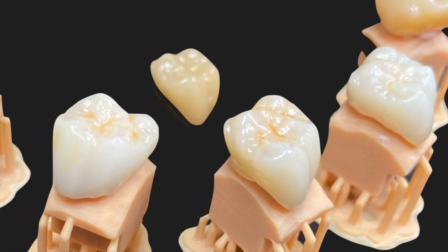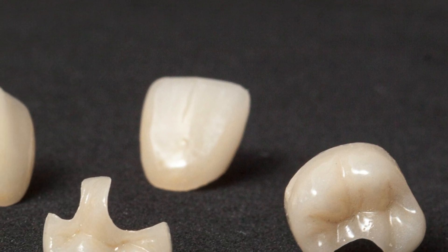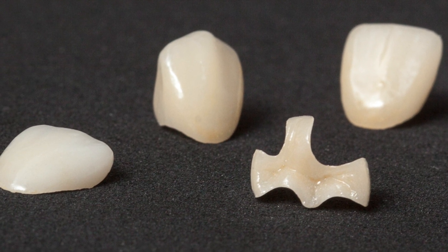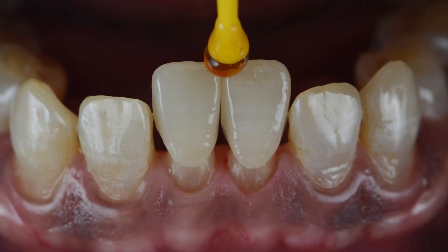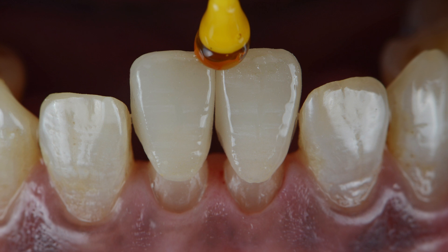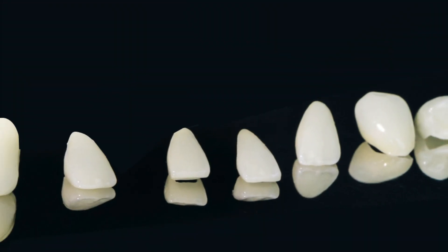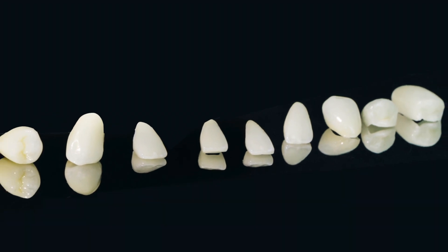We're often told that clinicians need to choose between aesthetics and strength, but that's not the case with Suprenity because it's comparable in strength to lithium disilicate such as Emax. Because of its brilliant aesthetics, thanks to integrated translucency, opalescence and fluorescence, it's typically my first choice when it comes to working in the aesthetic region, mainly bicuspids and anteriors.